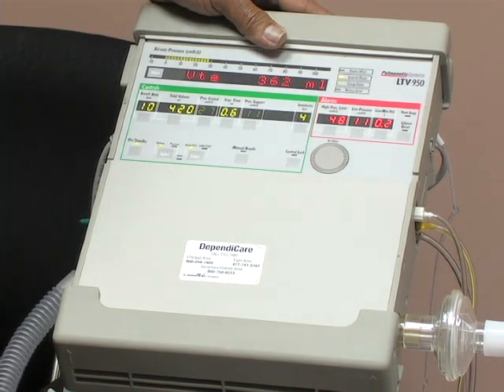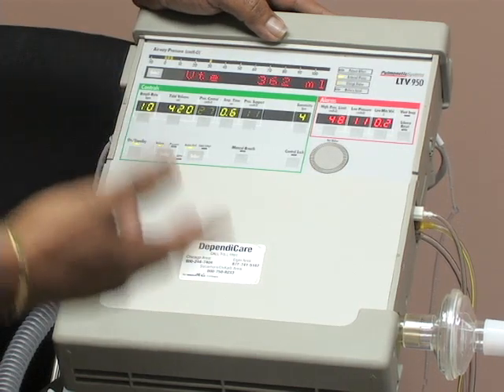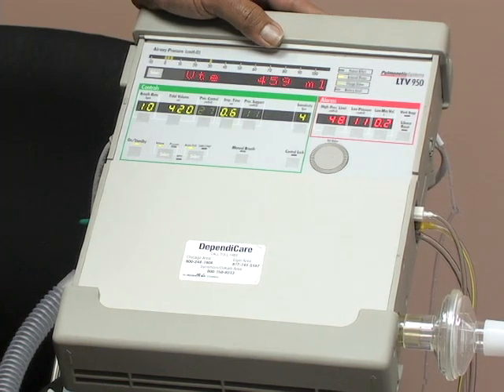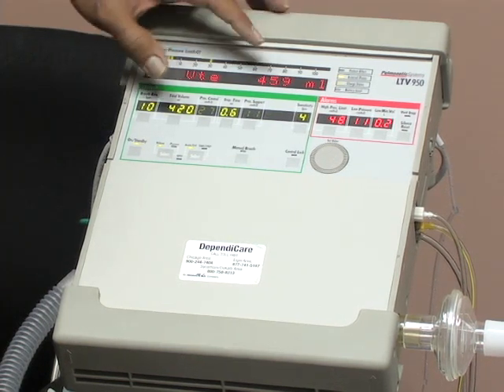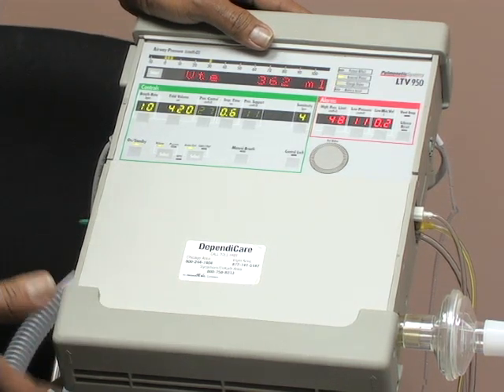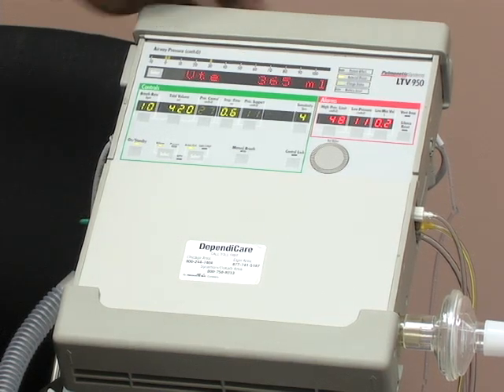This could also have a lower number if you had some leaking within your circuitry somewhere. So this is why we do a leak test prior, but looking at these numbers and comparing them is a very, very valuable way to assess what's going on, not only with your circuitry, but most importantly with your client at that point in time.